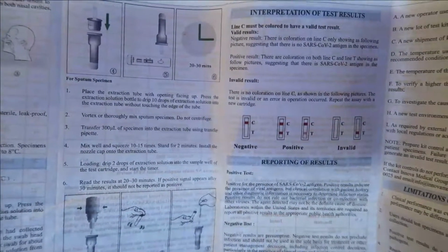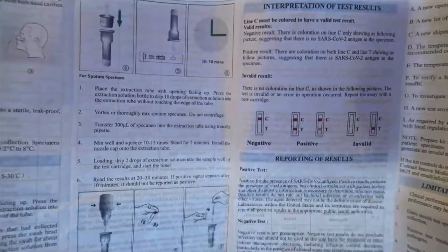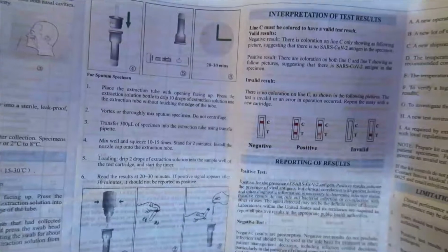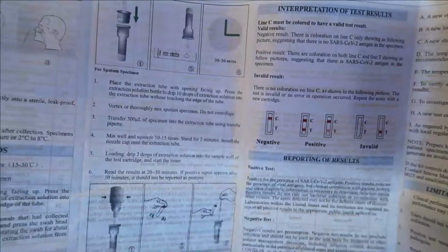And also, on the government's website, you can request a home test kit. I think I've done a video before about the home test kit that the government has provided, and I think that is more complicated, to be honest, in the sense that there are so many steps. At the same time, the main disadvantage is you have to wait for them to text you the result. This one is immediate. It's 20 to 30 minutes and you will have your result, but that one is more accurate than this. So this is just a guide for you, a constant check every 2 to 3 days whether you are positive or not, even though you are not showing any symptoms. So that's the positive side.